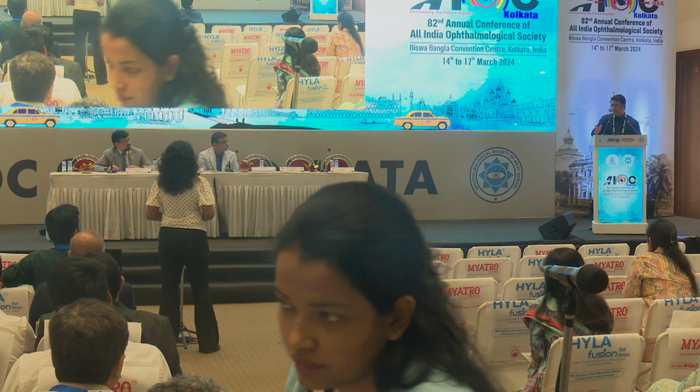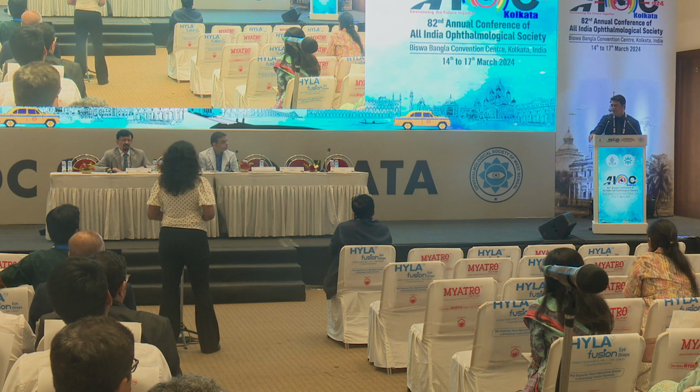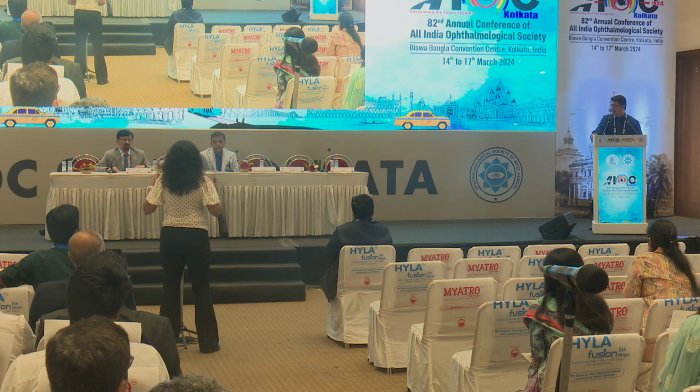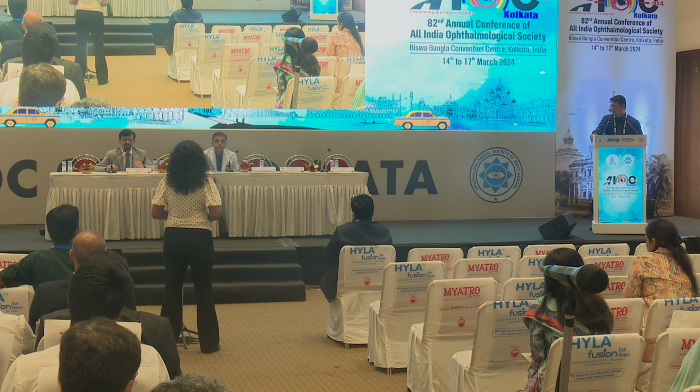And on the flatter side, 40, 39 also I've done. But free cap is not a major problem. Of course, in steeper corneas, buttonhole is a problem. So sometimes the cost is an issue for patients. Then more than 46 is my criterion.